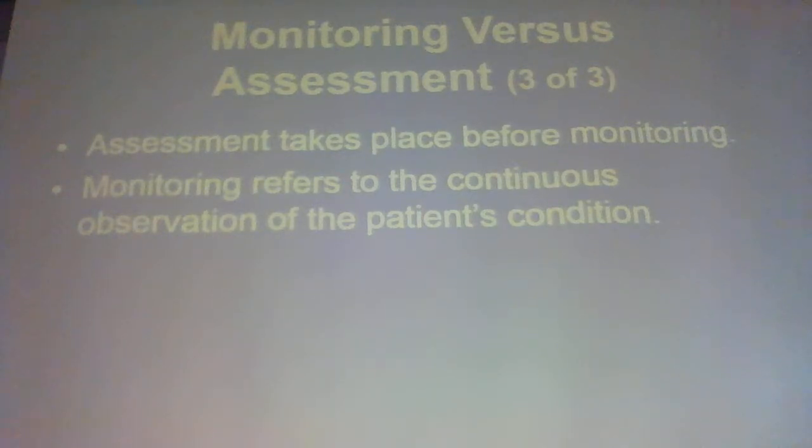We just know that standard of care is anybody that's sick, we monitor their four lead. But if you really think it through, why are we doing that? Because they said so. Yeah, but if you think about the rationale for monitoring somebody, what's the rationale?